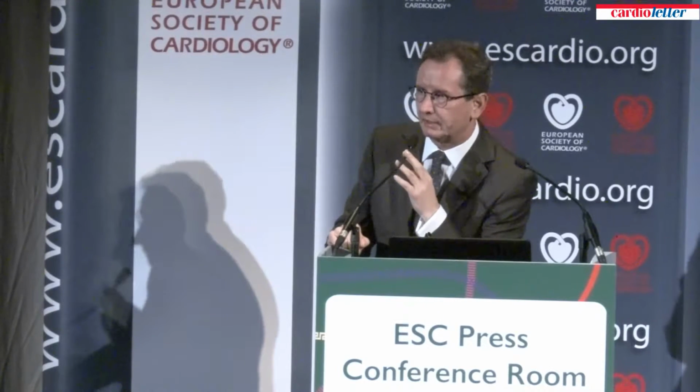Most of the restenosis occur on side branches, which are by definition smaller than the main vessel. And usually these restenosis are quite short. Did you assess by FFR whether there is some ischemia induced by this restenosis? Yeah, we check it, our patients, we try to have a complete angiographic follow-up.